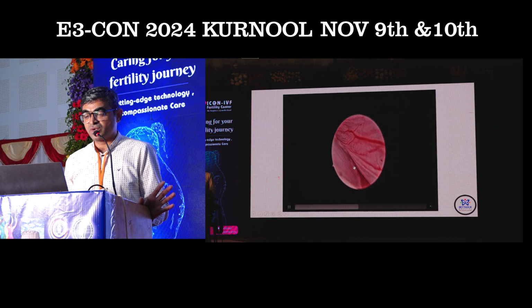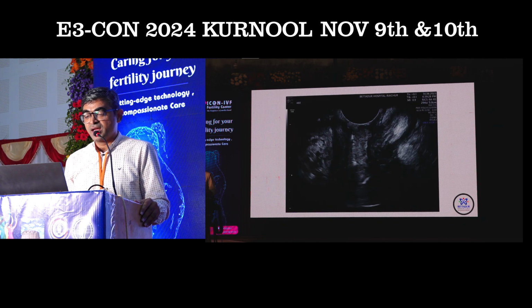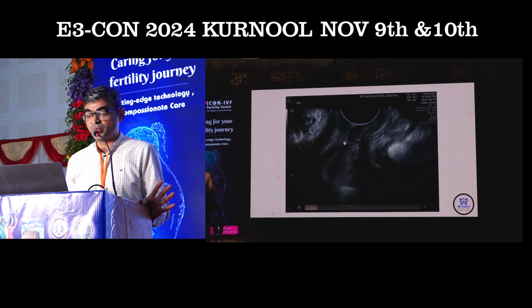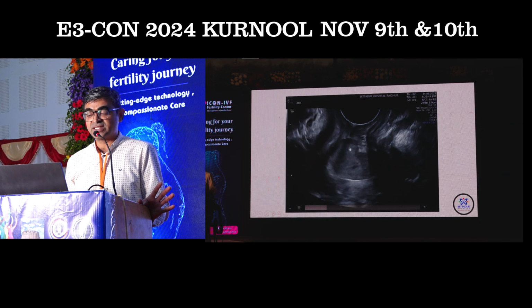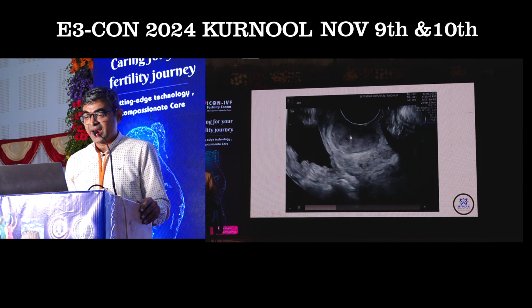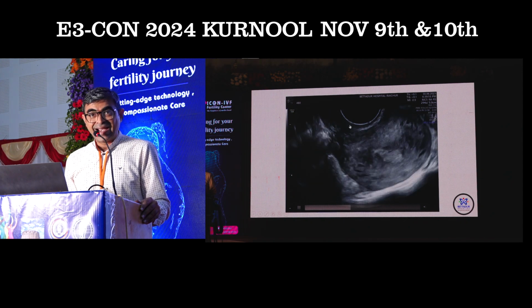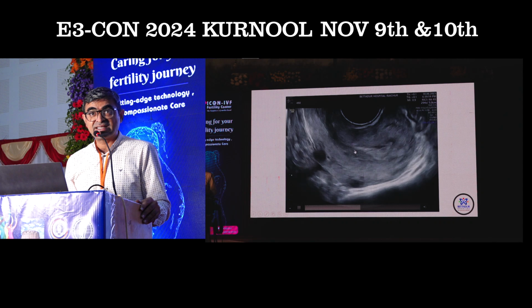transvaginal sonography slowly is that here again you are able to see a circumscribed lesion standing out. This is soft in its consistency because I am able to slide and put my probe, and it is getting compressed. I was also able to see the planes getting differentiated between the upper lip and the lower lip. So now I did some maneuvers in the same uterus, though the color is different now. I made it anteverted because it was a long cervix. I gave some pressure, because I wanted to know from where exactly it was coming.